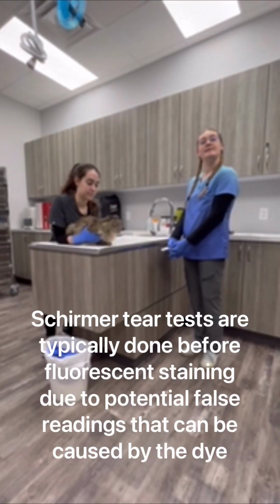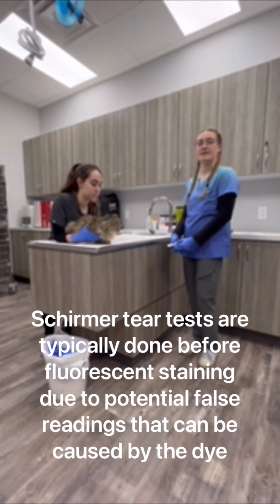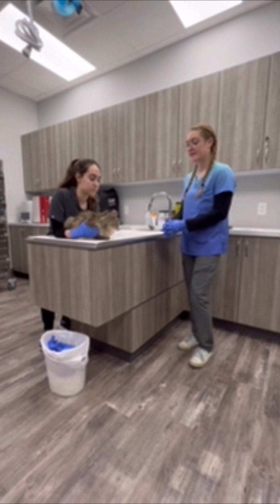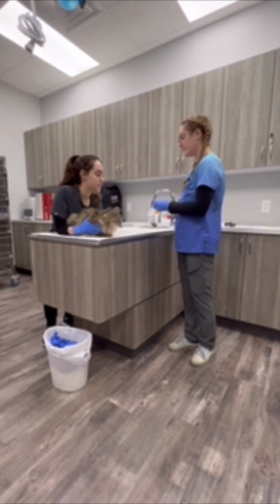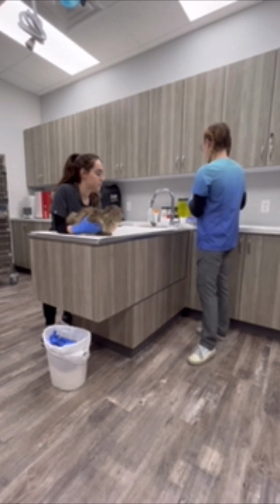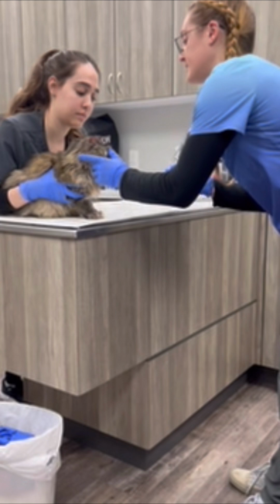I am now doing the Schirmer tear test. Typically in our practice we will perform this Schirmer tear test prior to doing the fluorescent dye staining. So I will begin with taking a strip out of the package, and I'll be starting with the patient's left eye.